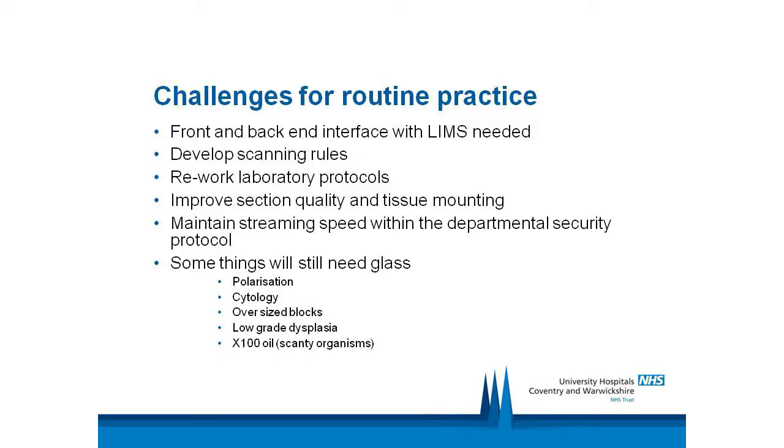Otherwise, I think it works pretty well, but there remain a few challenges to adoption in routine practice. The interface with the LIMS is still ongoing in Coventry. We hope to get that running soon, but we really can't use it in anger until that's been put in place. Each laboratory will have to develop their own scanning rules about how they handle cases and what magnification they're going to scan them on. And inevitably, when you make a change like this, the laboratory protocols have to change.